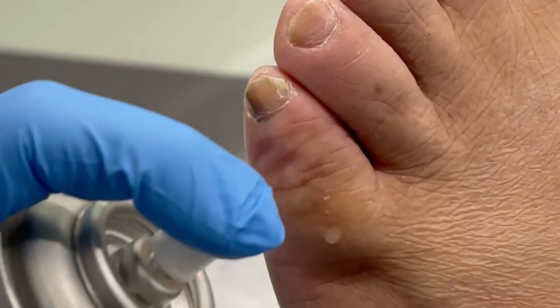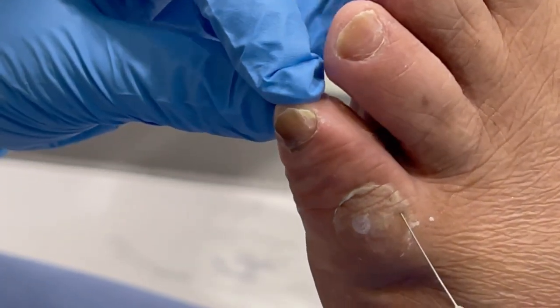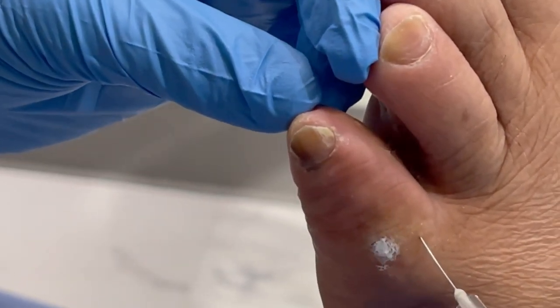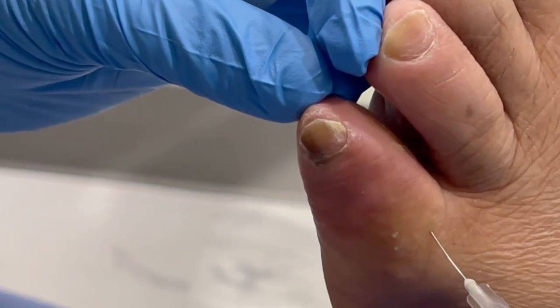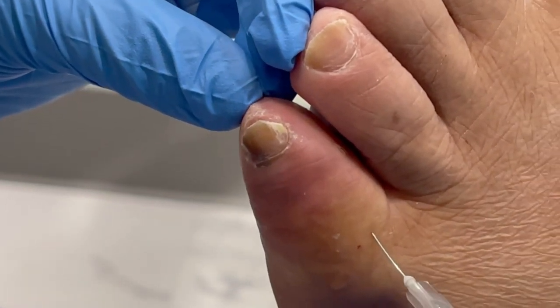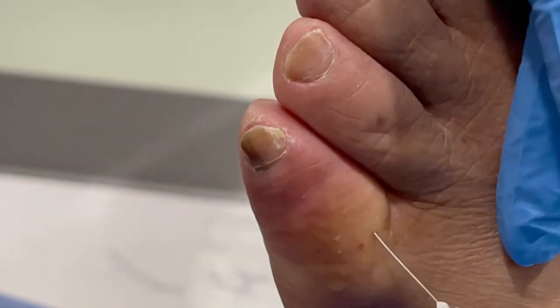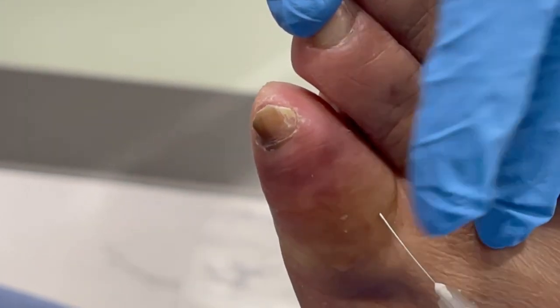A little more on that side — we don't want you feeling anything. Doing great. Do you guys have any questions for me? So Alex is going to go over how you're going to take care of this, but just to give you a general idea: you'll soak it every day and sprinkle a little collagen wound powder in there — it looks like snow — and keep it covered. We need to get you an excuse for tomorrow.